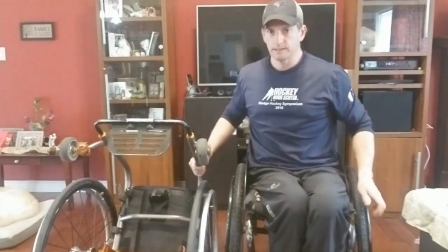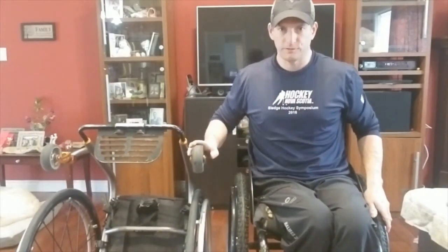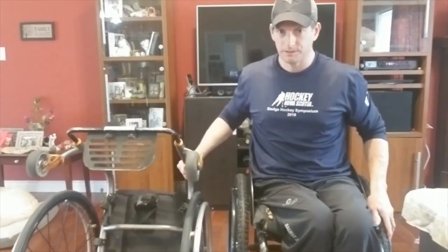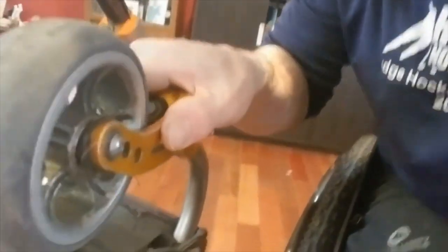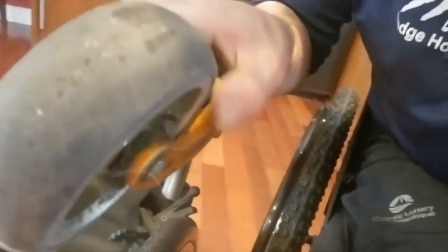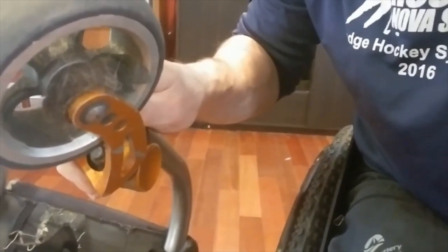If you can see here — I'm going to go a little bit closer — these are way past servicing. I should have done this months ago. Generally I would clean these out every month, every month and a half, two months at the latest, to keep it clear of the dog hair, because these front caster wheels pick up everything. You can see the dog hair, kid hair, probably my hair — it's all in between the front caster.